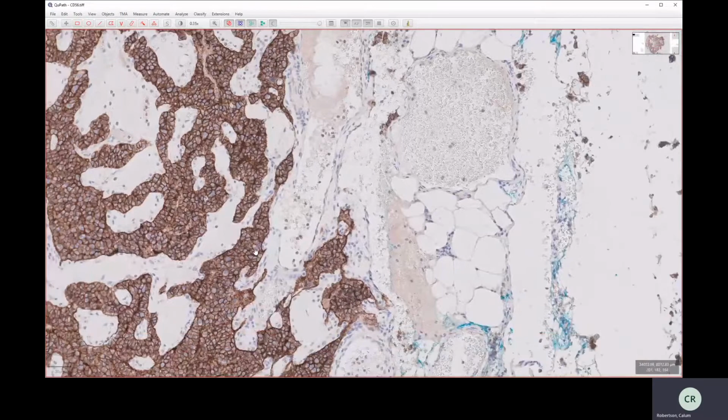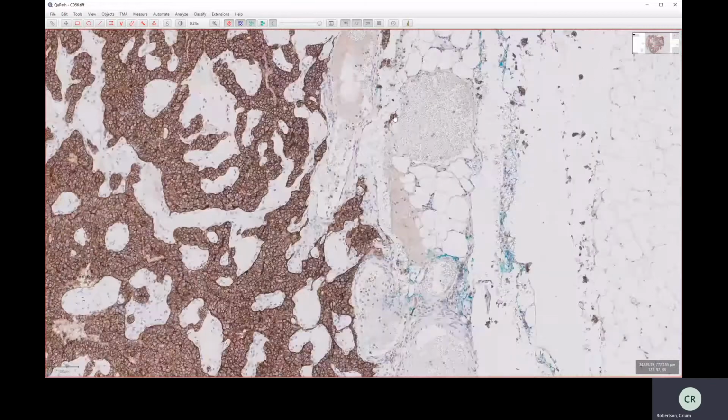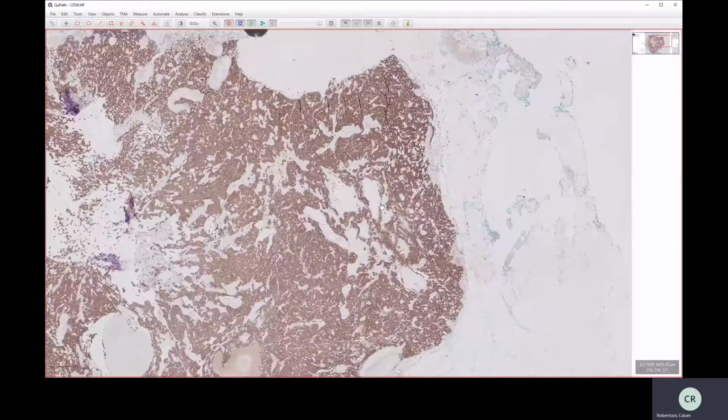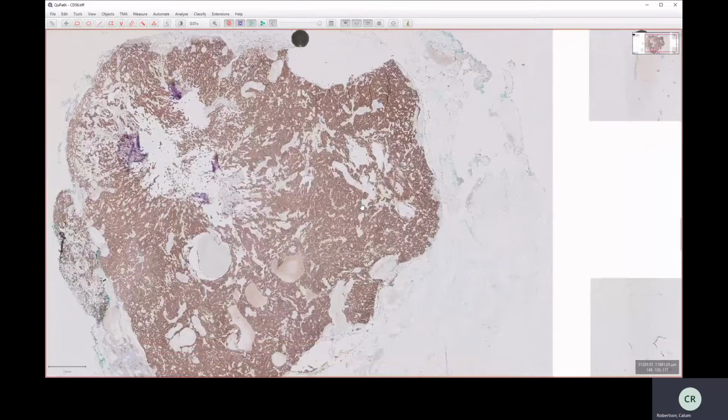We don't use eosin, just hematoxylin to stain the nuclei, so we can see where the cells are. You can see the blue nuclei within the tumor, within the staining bit, and also out here within the non-staining bit. It helps you see the tissue architecture that way, not as good as an H&E for looking at morphology.